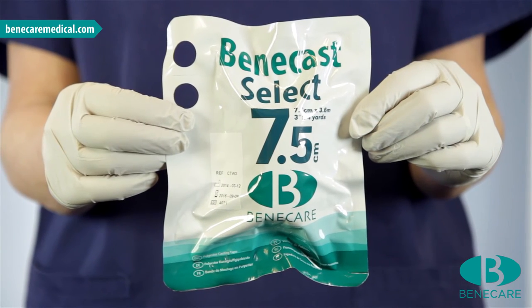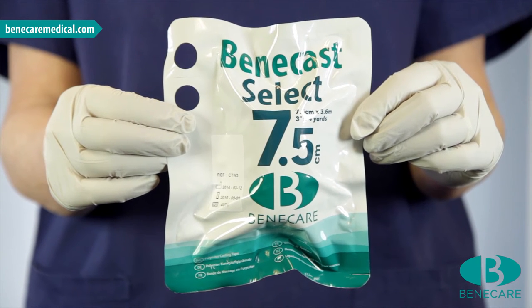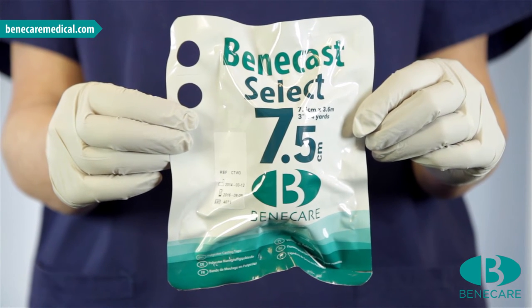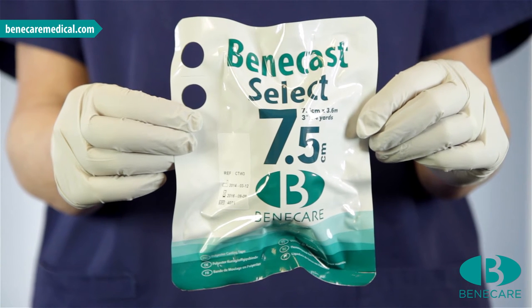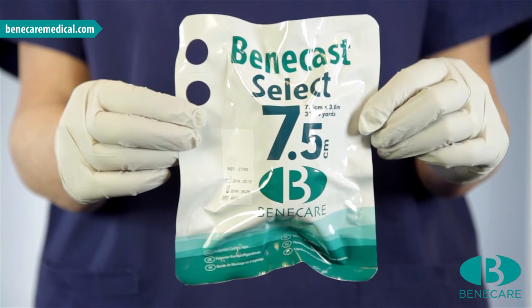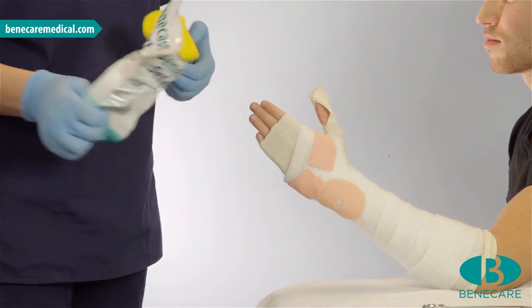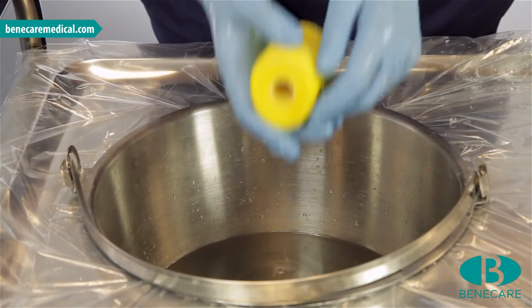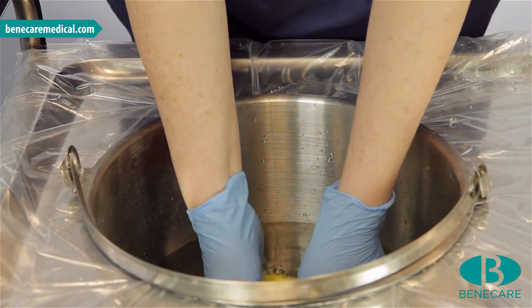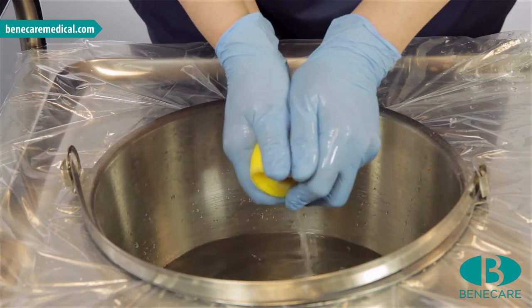The setting time can be varied. Several squeezes in the water and to squeeze out of the water will provide a 4-5 minute set time, or dip in the water for 1-2 seconds and squeeze only out of the water — this will provide a 6-7 minute set time. Remove the casting material from the pouch and dip the roll into the bucket. The water should be at room temperature, 22 degrees, and the dip technique appropriate to the level of skill and indication.